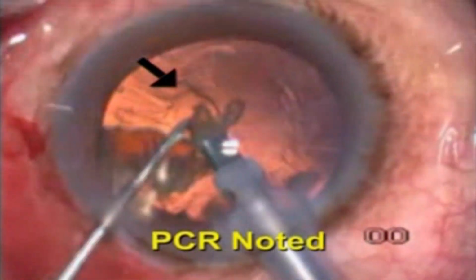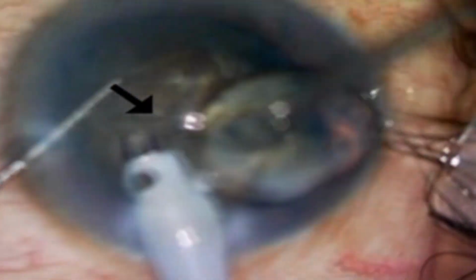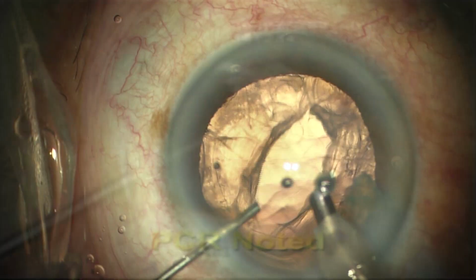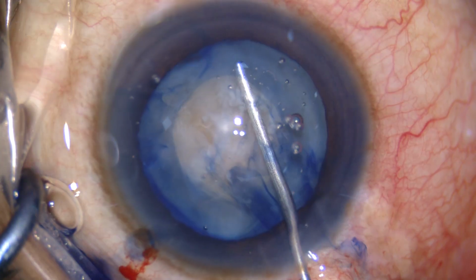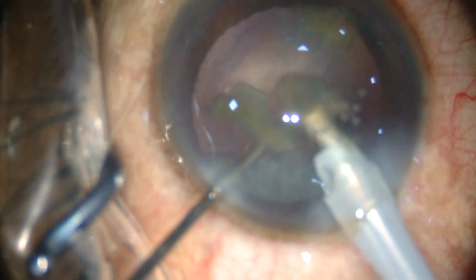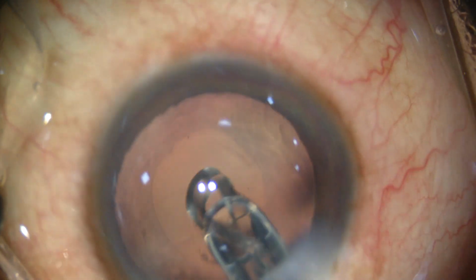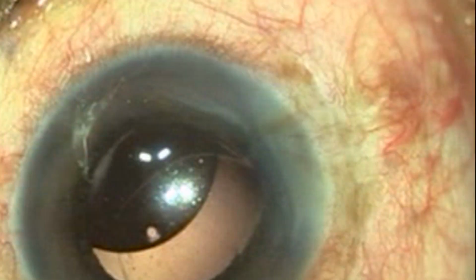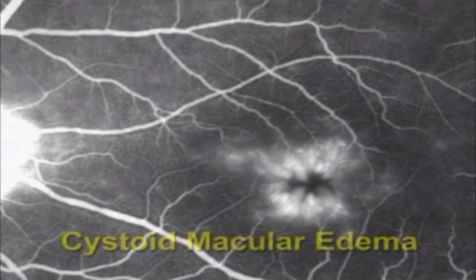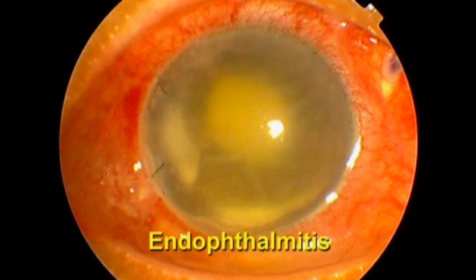Early recognition combined with advances in instrumentation have enabled effective management of posterior capsule rupture and vitreous loss during phacoemulsification. Posterior capsule rupture can occur at any stage of phacoemulsification, for example, during hydrodissection, nucleus removal, cortex removal, posterior capsule vacuuming, and during IOL implantation as well. Failure to manage the PC rupture and the vitreous loss correctly can lead to cystoid macular edema, retinal detachment, secondary glaucoma, and even postoperative endophthalmitis as well.